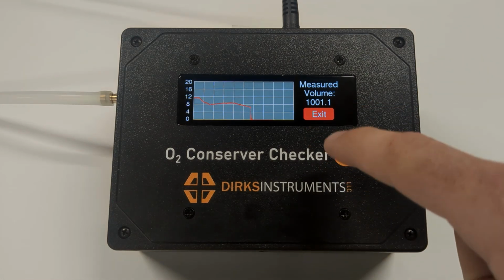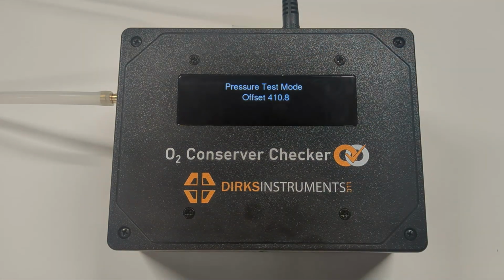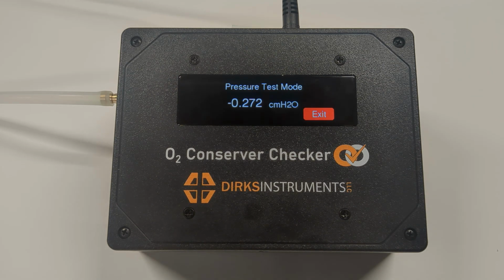The next function we have is the pressure test. This test will turn the fan on at a low speed to generate a slight negative pressure, similar to what is generated during normal operation. The display will update with the current measured pressure. You can connect a calibrated pressure sensor to the inlet port of the device and verify that it is reading the same value as the sensor on the checker.